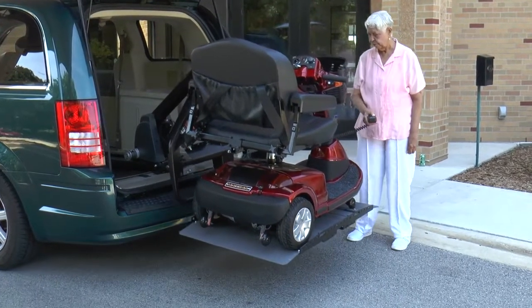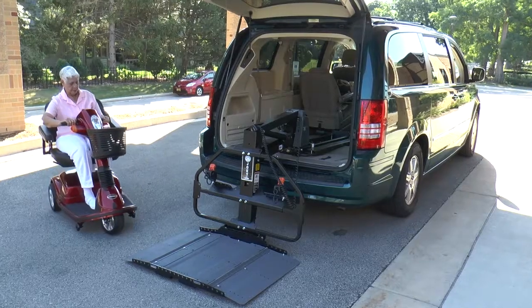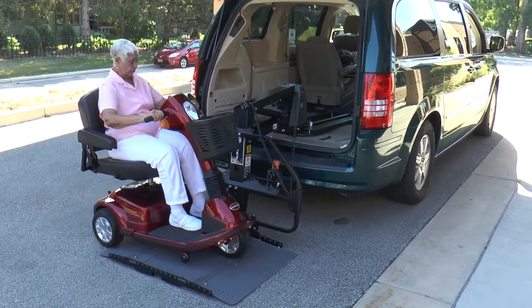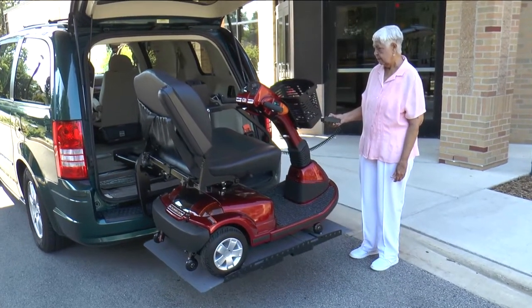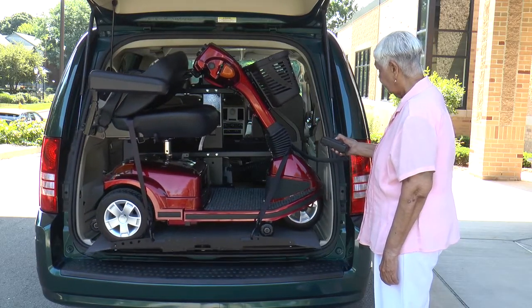Transporting a scooter or power chair doesn't get easier than with Bruno's Joey. Designed for minivans and full-size vans, the Joey offers a drive-on, drive-off platform and one-button simplicity to quickly and easily load mobility devices weighing up to 350 pounds or 159 kilograms.